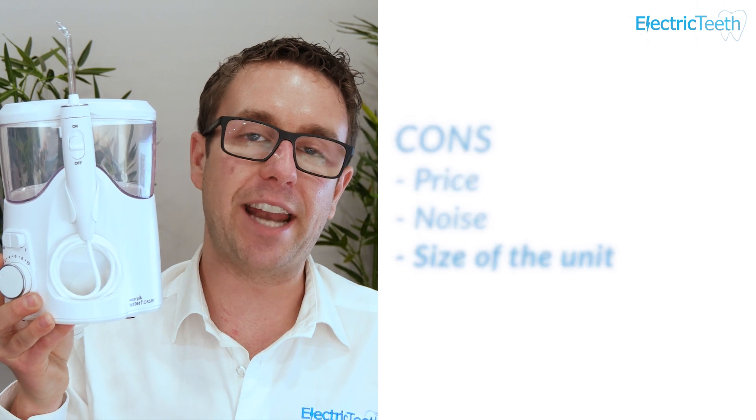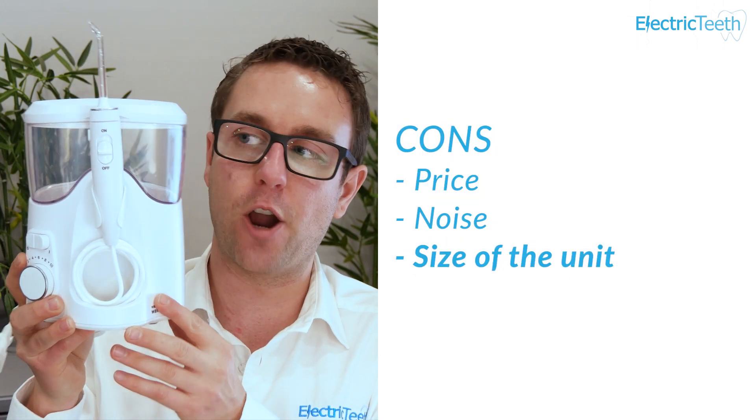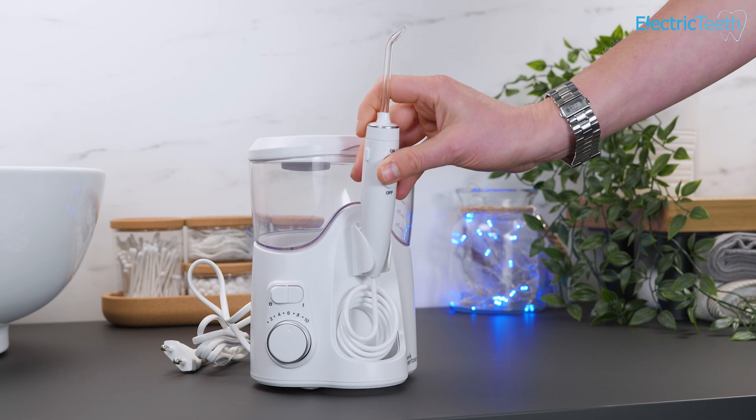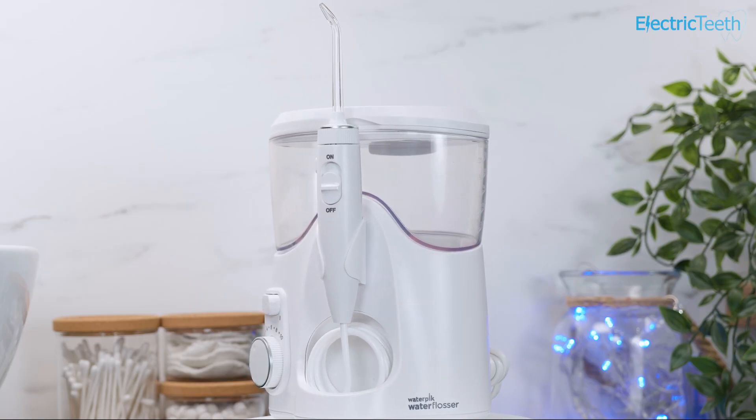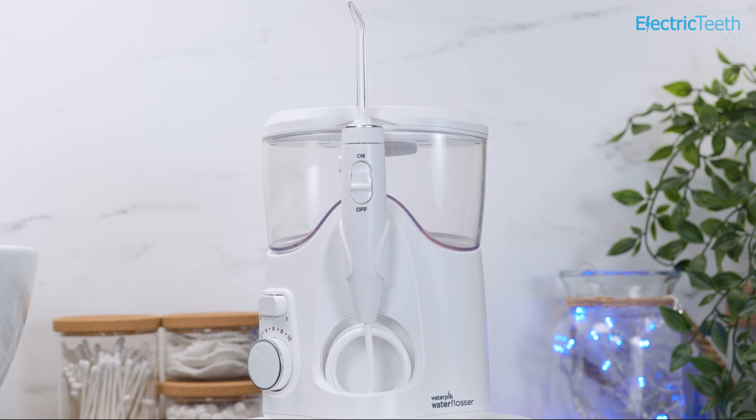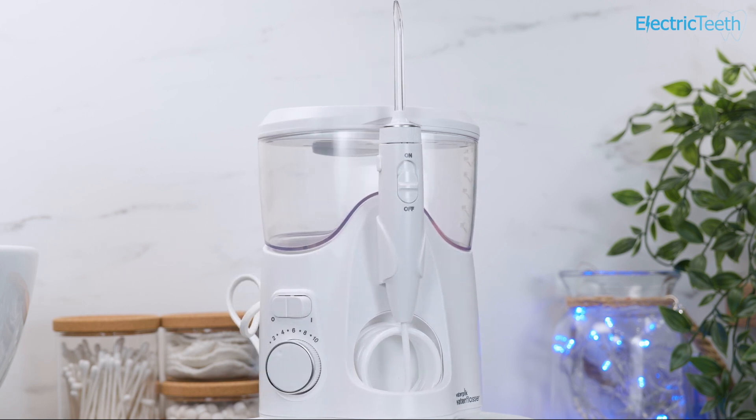The last con — and it is a small one — is the overall size of the unit. It's not massive, but in some bathrooms there isn't a lot of space for these types of unit and it can take up valuable countertop space. Factor in the power cable that needs to be connected and they can potentially be a little cumbersome. All countertop water flossers are around about this size, but it's something to bear in mind.